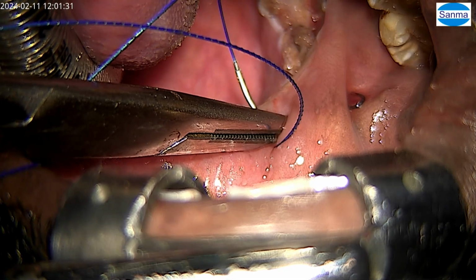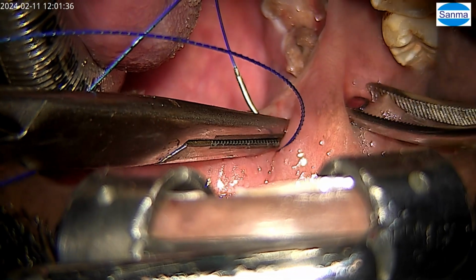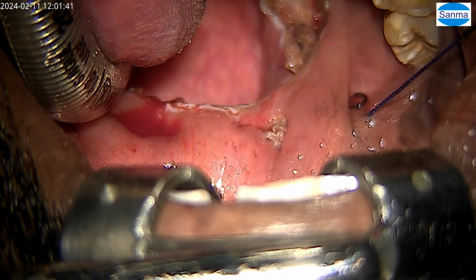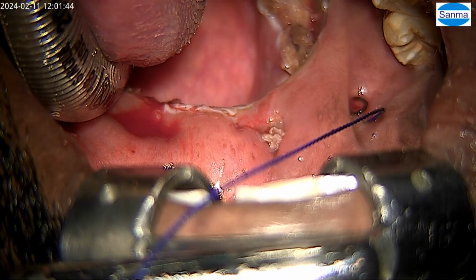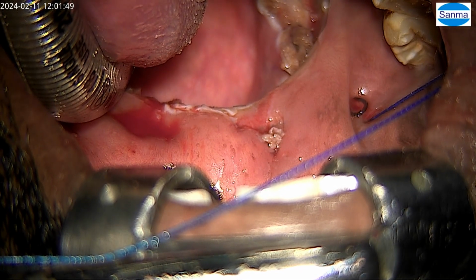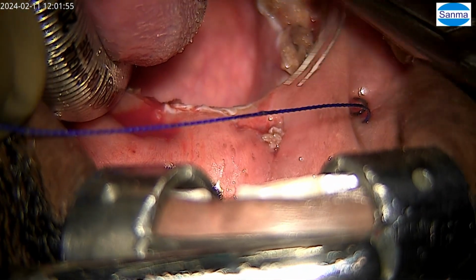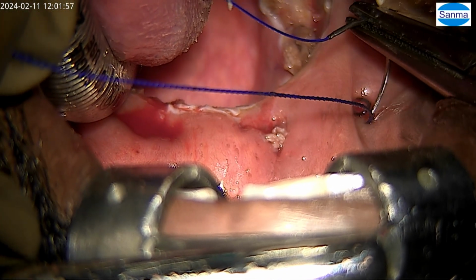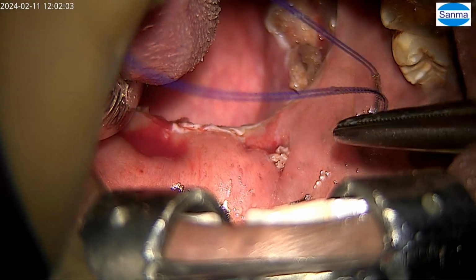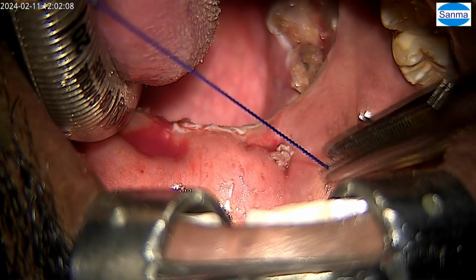All right. Am I with you, sir? Yes. So, sir, as you saw, I went from left to right, right to left, and left to right. Now I've come out lateral to the raphe, right? So this is our support, and now we'll have to cut it off. But before cutting, I'll again take a U-turn, because the moment you take a U-turn, your suture would not come out easily. Because the loop is inside. We went to the other side, came back here, and we'll just take a U-turn for a short distance in any direction, doesn't matter, almost a 180 degrees.